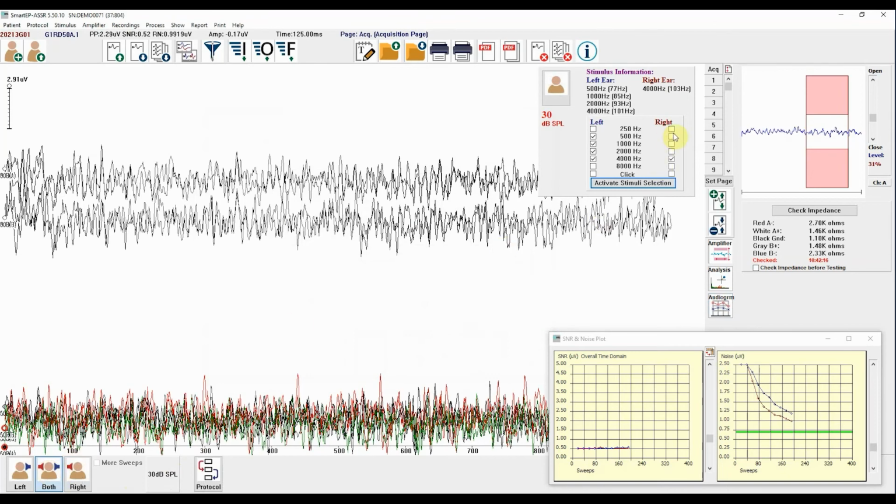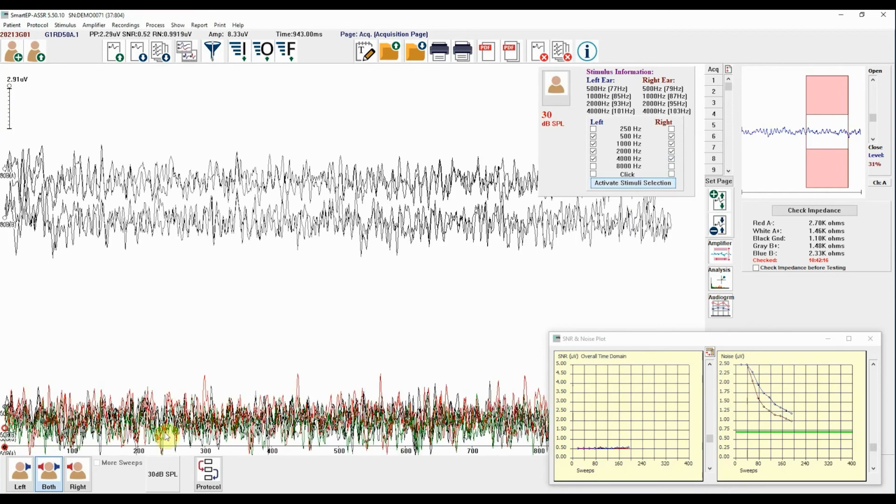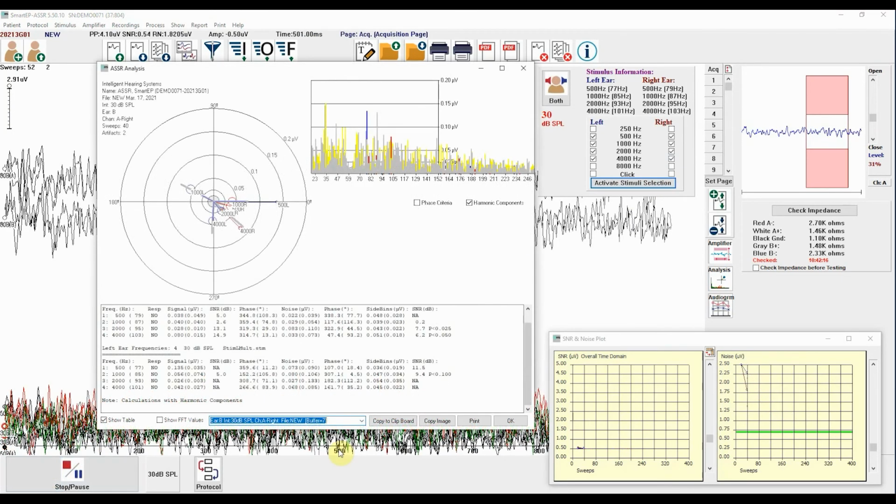One of the field strategies clinicians take is waiting for a minimum of 80 sweeps to be registered and averaged before making any decisions to stop the acquisition manually. Clinicians look for a repetition of blocks of sweeps in determining their stopping criteria. Most users typically lock in responses anywhere between 120 sweeps and 240 sweeps. You should consider stopping when responses are solid and repeatable.